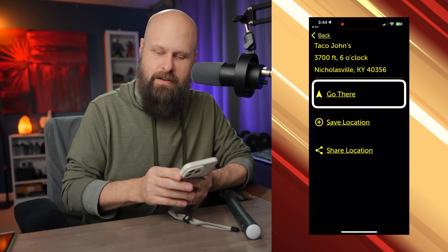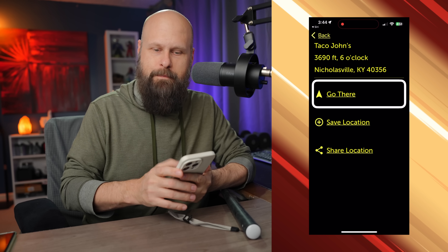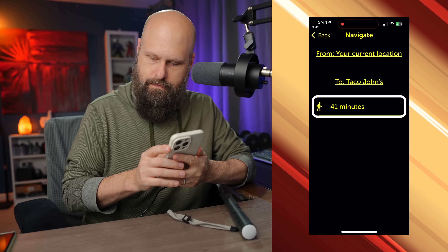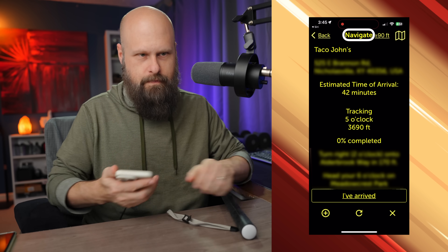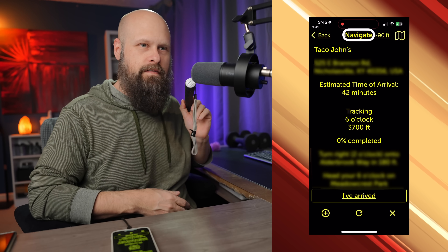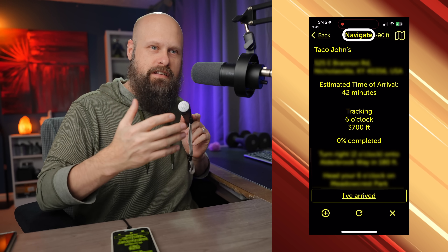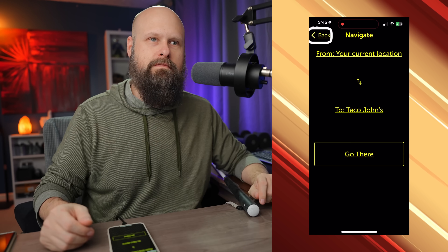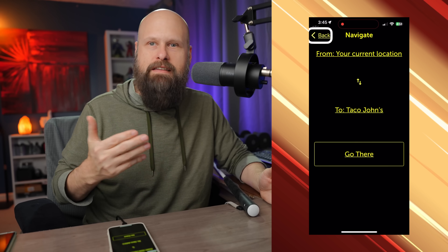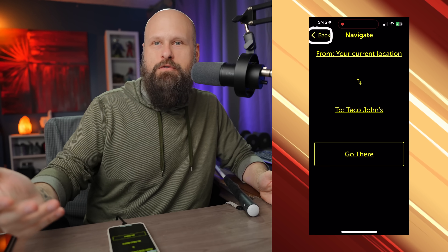From the item detail, you can hit Go There or Save Location. Hitting Go There gives me a route from my current location to Taco John's — walking, 41 minutes, 6,690 feet away at six o'clock. Now we start to get turn-by-turn navigation instructions from the cane: 'Turn right, two o'clock.' This works like most turn-by-turn GPS navigation apps, giving walking directions to your destination. The key difference is that when paired with the cane, audio comes through the cane's speaker.